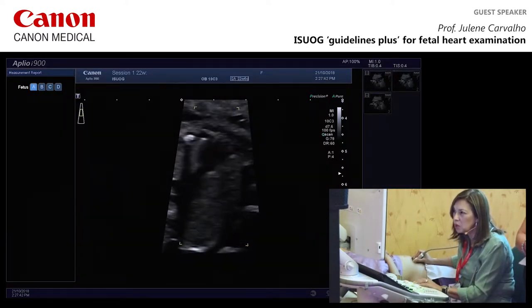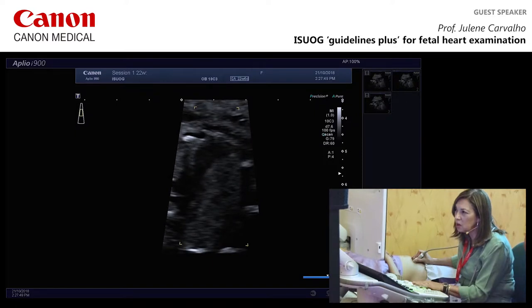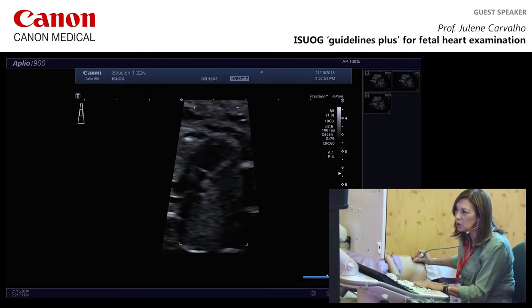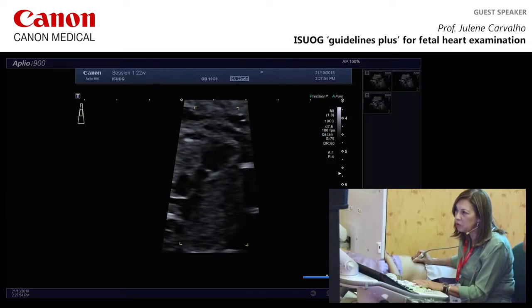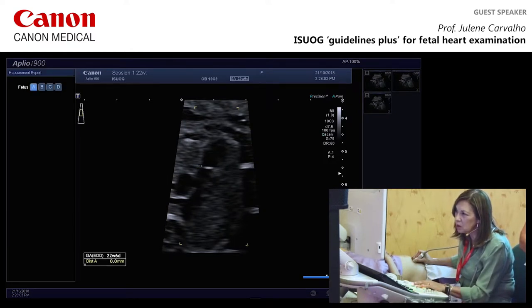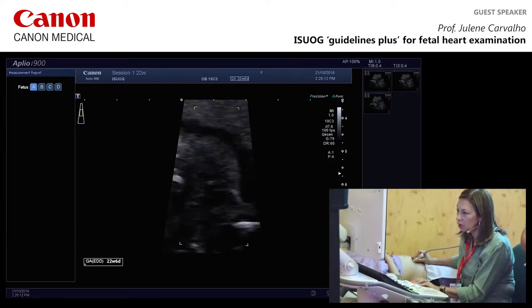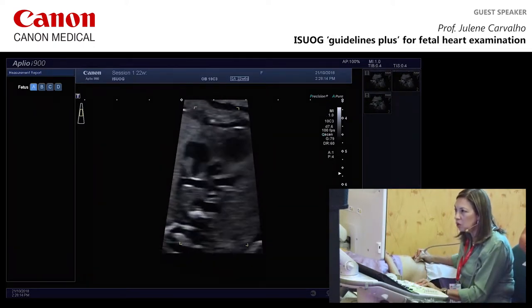Tilting upward to the pulmonary valve: freeze and look for the valve closed and open. Not quite the best plane to measure, but it gives an idea. The pulmonary valve should be slightly bigger than the aortic valve — here it is 3.8 mm against 3.7 mm for the aortic valve.